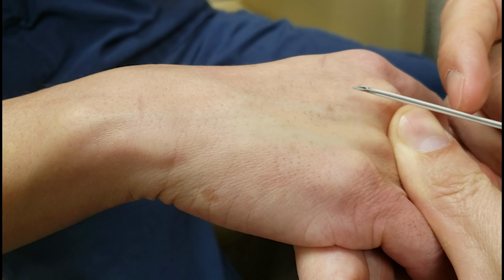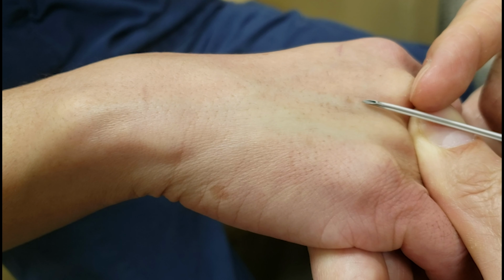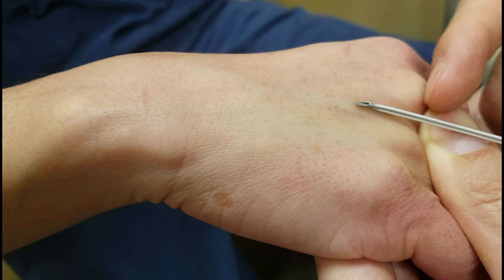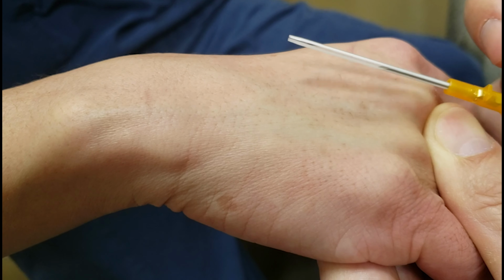So then here I start, I advance 1 millimeter, I get a flash. I know that this is a 14 gauge IV, so it's a 5 millimeter bevel. So then I have to advance another 4 millimeters to get the entire bevel in. Once I know my entire bevel is in, then I advance my catheter, then I'm in, and then we're done.